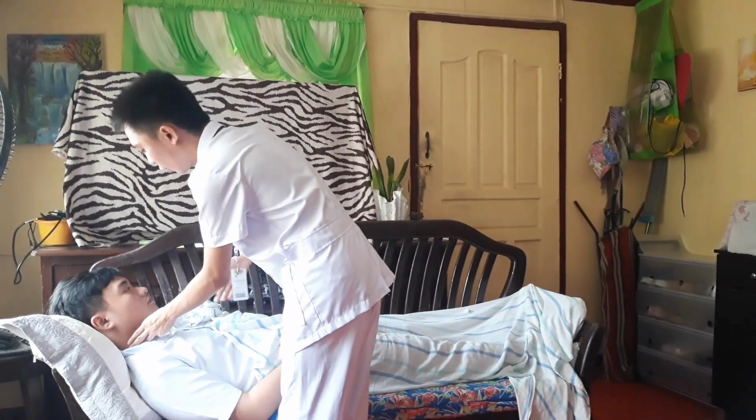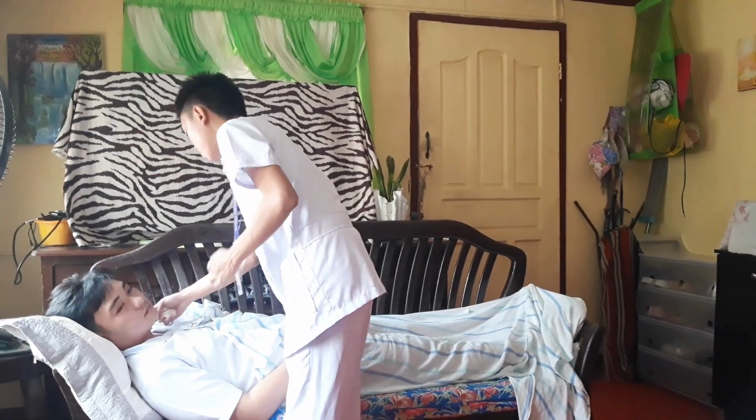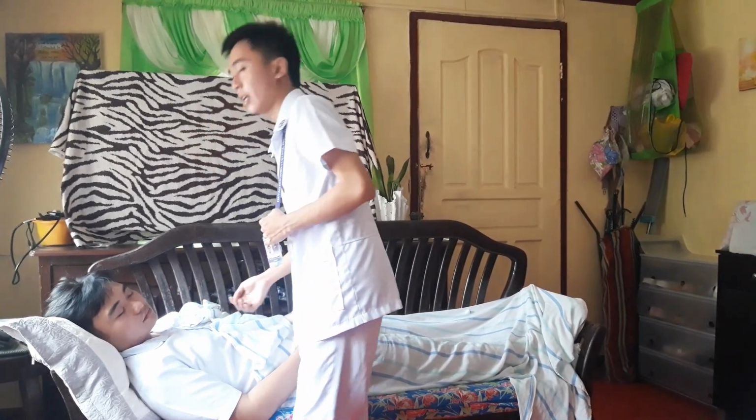So can you turn your head, sir, for me, please? Okay, thank you. So turn the client's head slightly away from the side being examined. Place the bell of the stethoscope over the carotid artery and ask the client to hold his or her breath for a minute, and auscultate the carotid artery, listening for a bruit. If a bruit was heard, gently palpate the artery to determine the presence of a thrill. So repeat the preceding step on the other side.